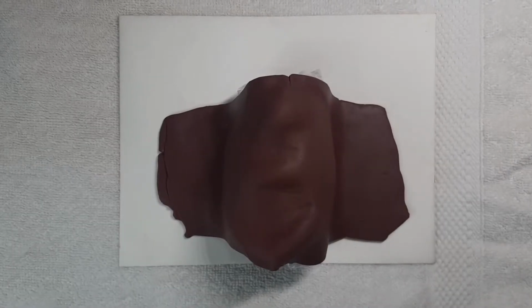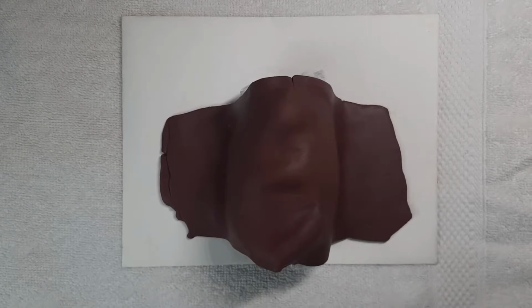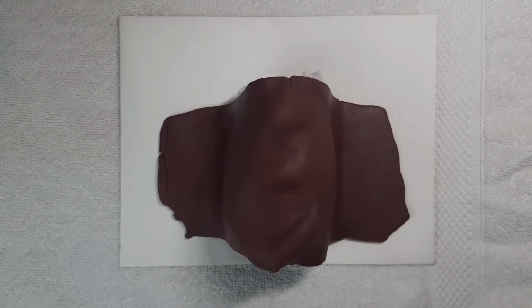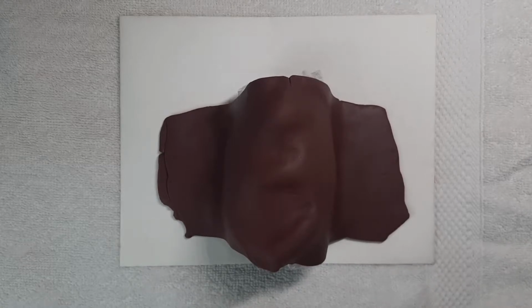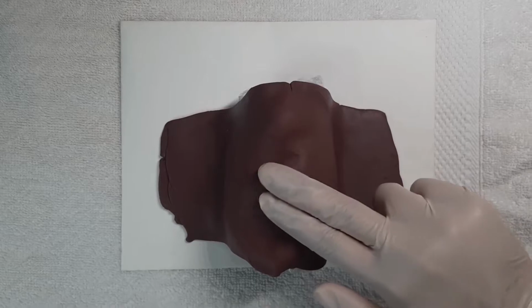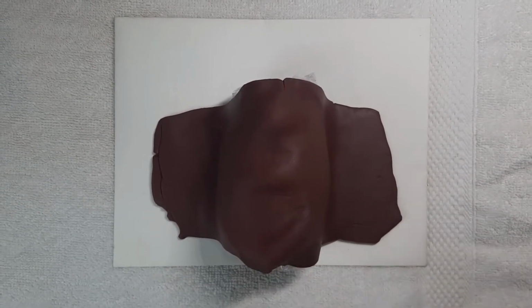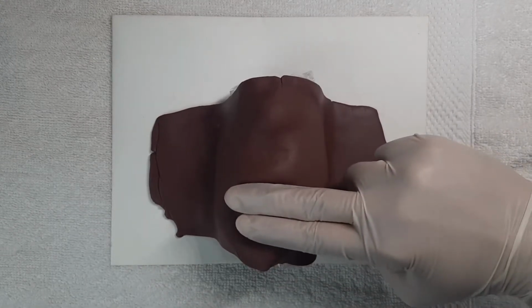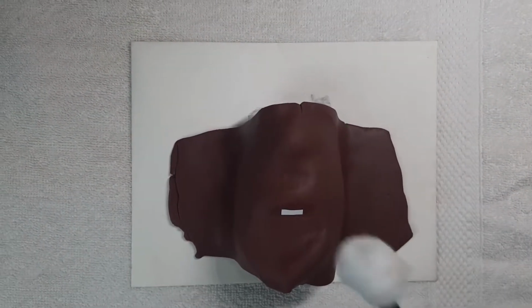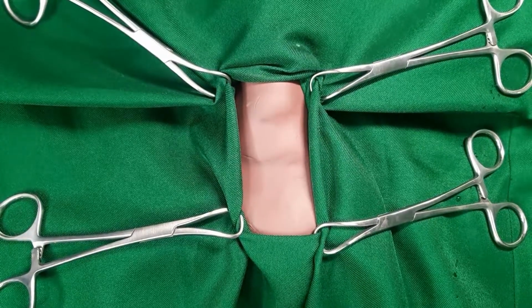First, place the patient in a supine position with the neck extended by the pillow or bag placed under the shoulders to deliver the trachea out of the thorax and to give adequate access to the cervical trachea. Then, palpate and identify the surface landmarks, starting with the thyroid cartilage, cricoid cartilage, and suprasternal notch. Then, 2 finger breadths from the sternal notch, mark a line for incision. Then sterilize the skin of the anterior neck and chest, and then drape the patient properly.